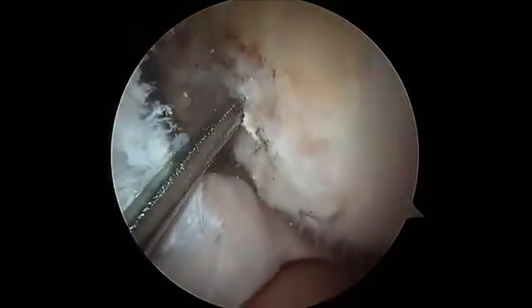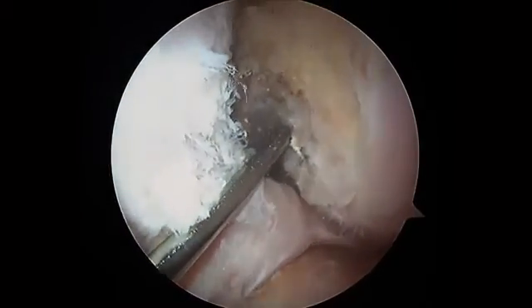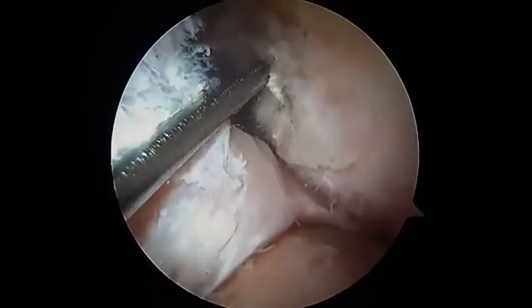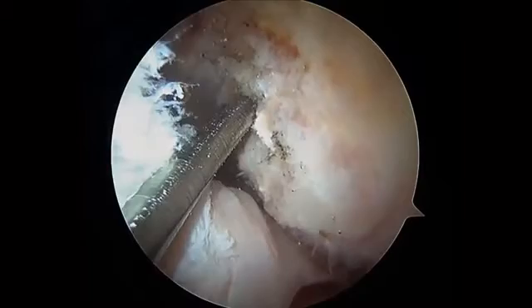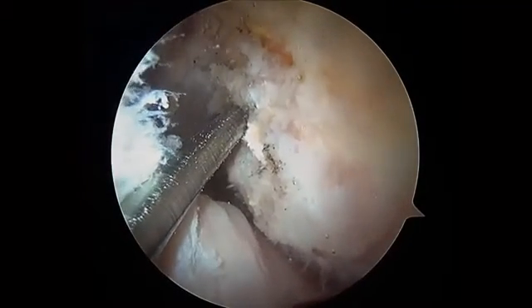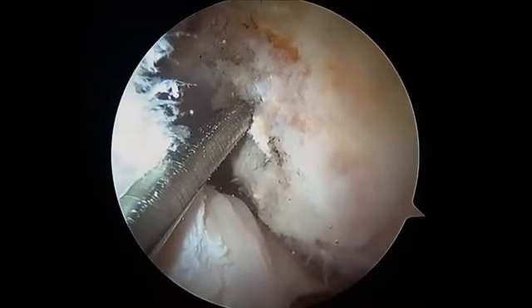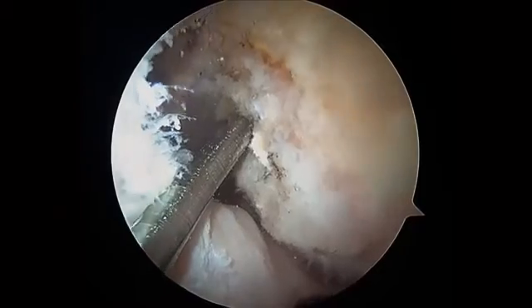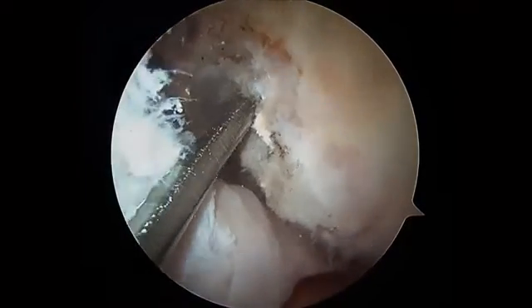So now looking at our position, you can see we're eccentrically located within the footprint, but we are within the footprint. We're going to encroach on the ridge, which is the direct region of the footprint. The direct fibers live in this region. We should be isometric. We should have low tension through the range of motion, and we're definitely within the footprint.